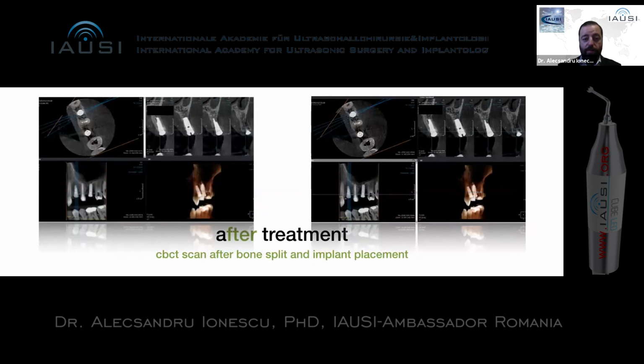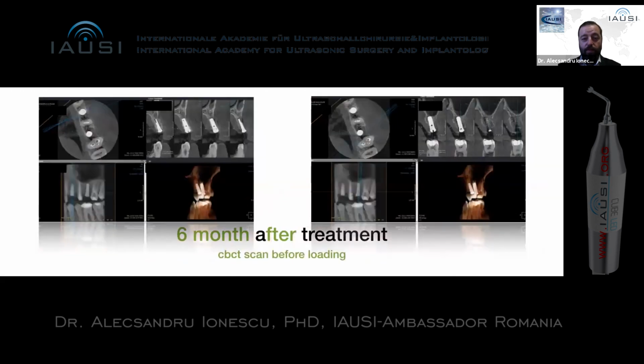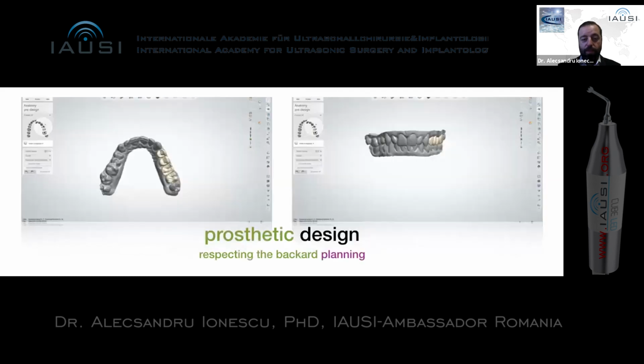You can see the CBCT after treatment, and there is a very nice but thin crest. And 6 months after, the patient was able to travel again, and you can see the difference from the initial situation to the existing situation. And you can also see how stable it looks, even for the narrow bone splitting that we did for this case.